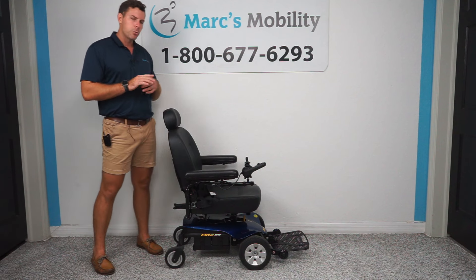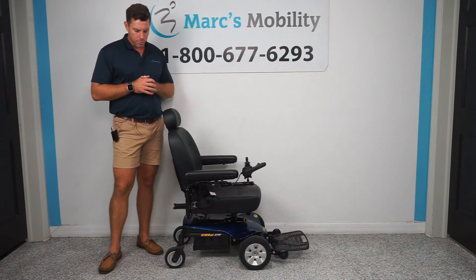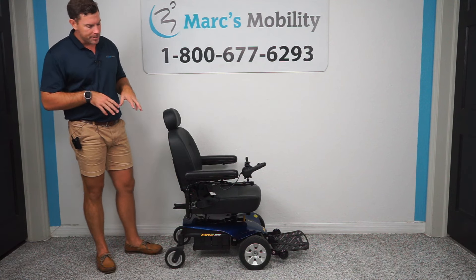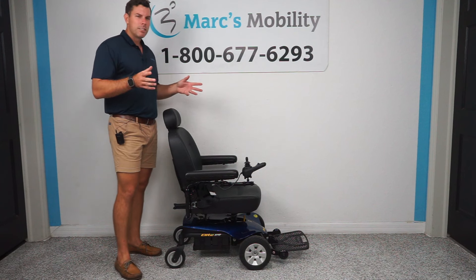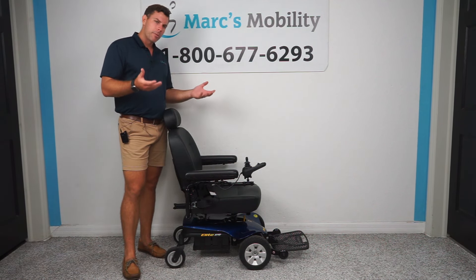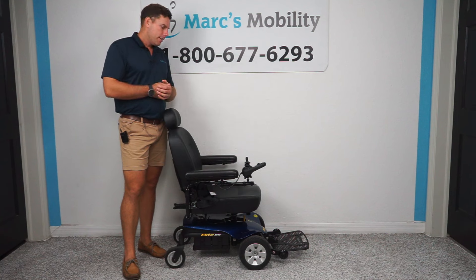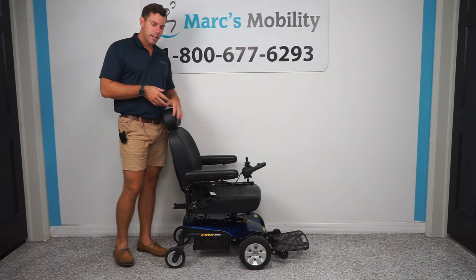This particular unit has about 25 hours of total usage, which is very minimal for a power chair — it was probably delivered and hardly ever used. Some basic specs: it goes a little over four miles an hour, has about a 300-pound weight capacity, and you can expect to get somewhere in the 12 to 15 mile drive range.